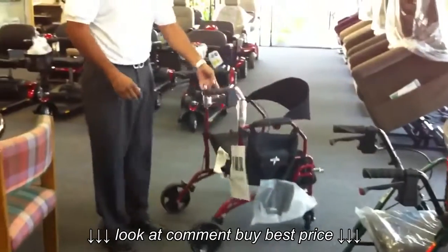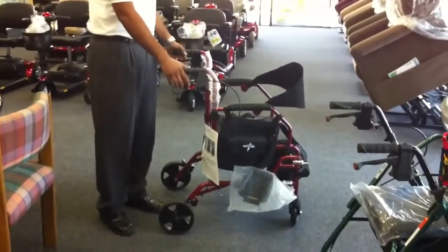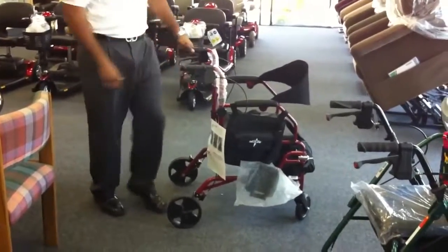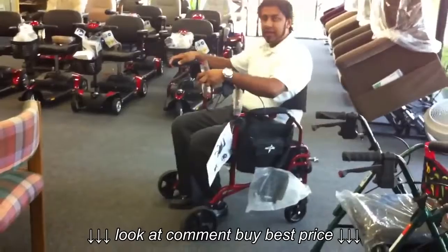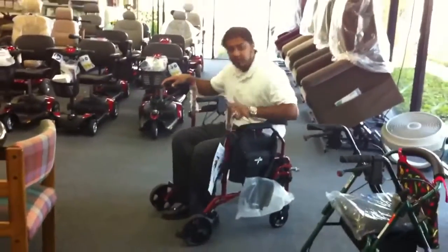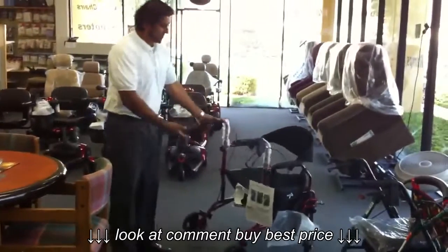But this new product incorporates the traditional rollator as well as a transport wheelchair. So how it works basically, you can use it as a walker and a seat. It has a nice curved backrest, which is very comfortable, and actually a much wider and deeper seat.